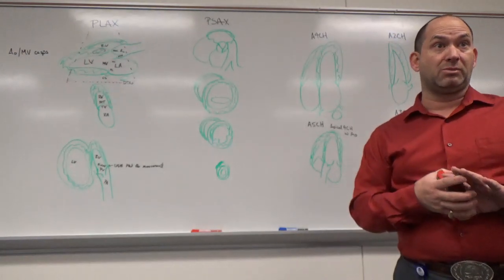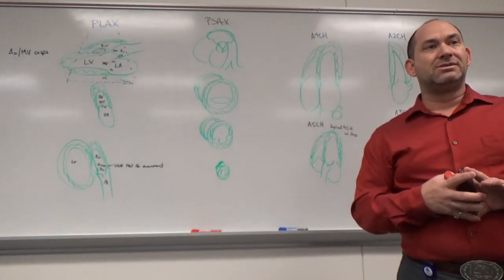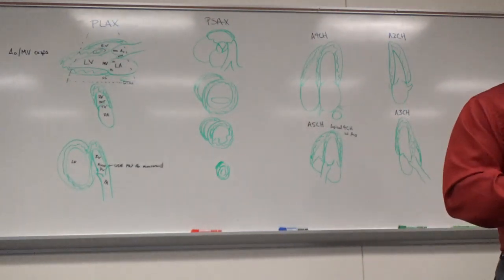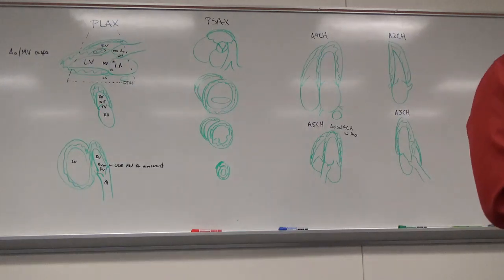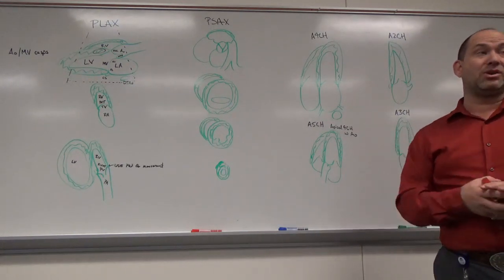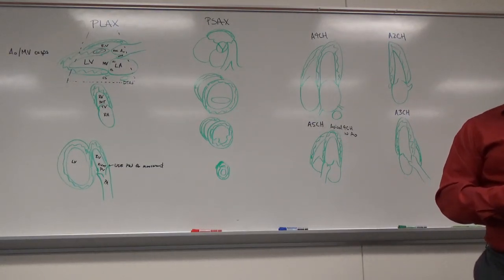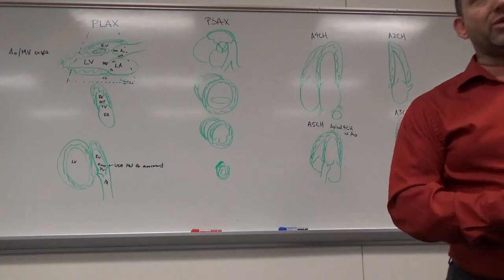The reality is, once you get good at this, and by doing the same protocol every day, by this summer, we'll be to the point where we can scan a case in an hour, 100 images and clips. Even a second year I was talking to, who's doing it in Coeur d'Alene, said she can get hers done in a half hour easy. Yes, or 20 minutes or something like that, and she's a student still. So it is completely doable. It's going to seem overwhelming, but we do get there, and you will get there.